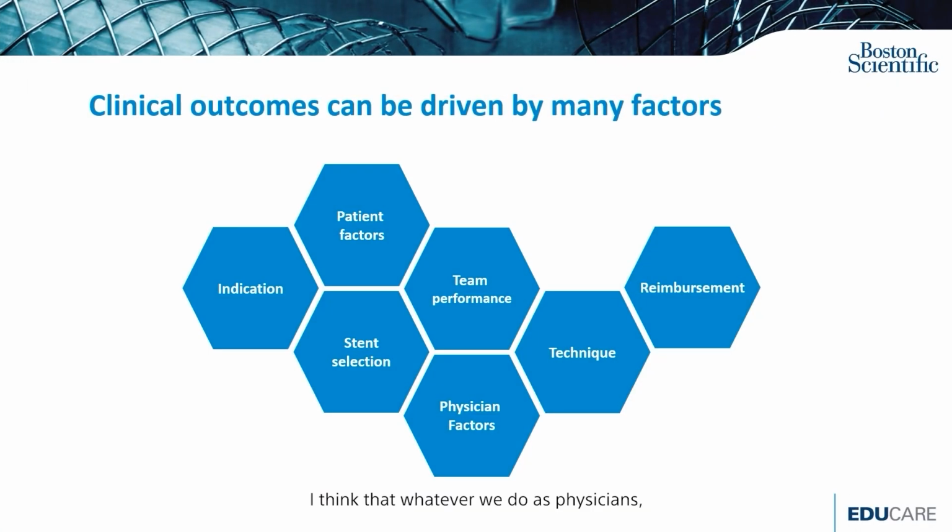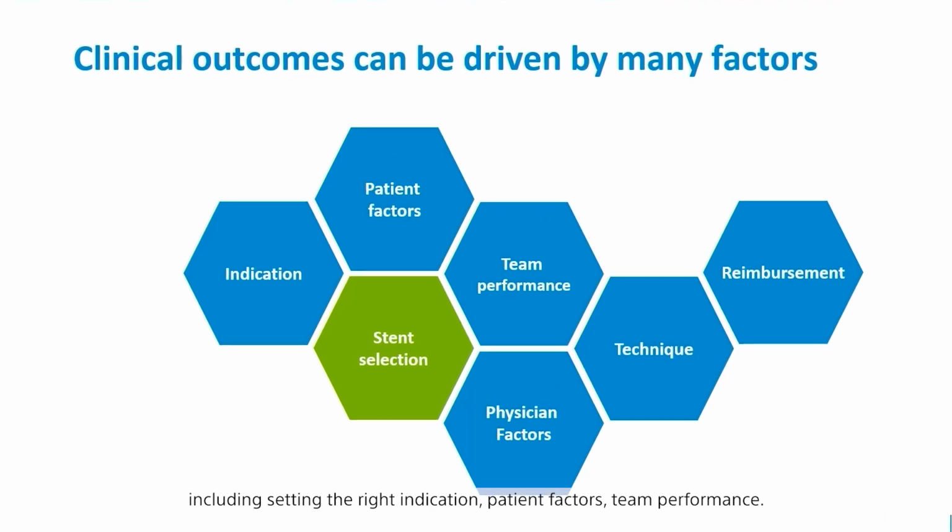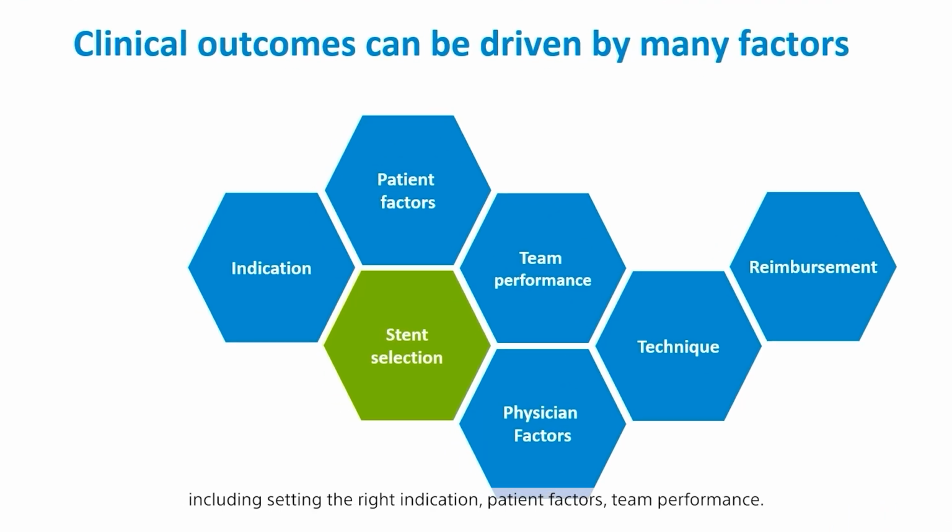I think that whatever we do as physicians, our main concern is the clinical outcome of the patients. And for an ERCP with stenting, this can be dependent on several factors, including setting the right indication, patient factors, team performance, but one of the factors is also the stent selection.